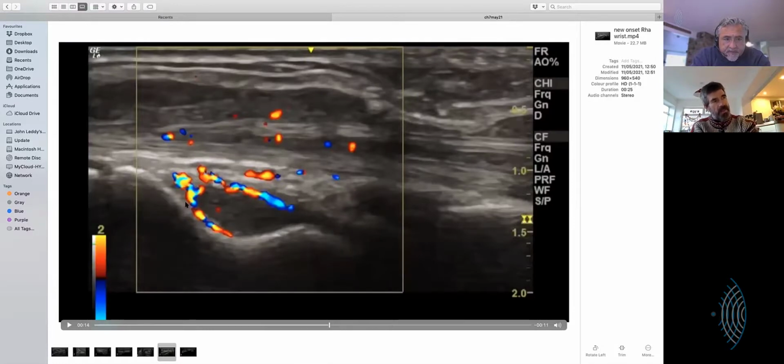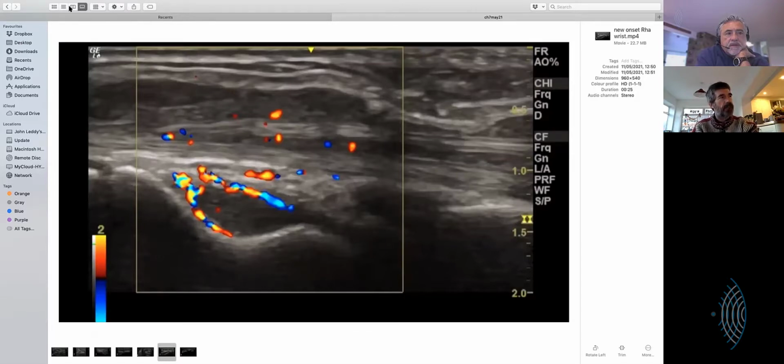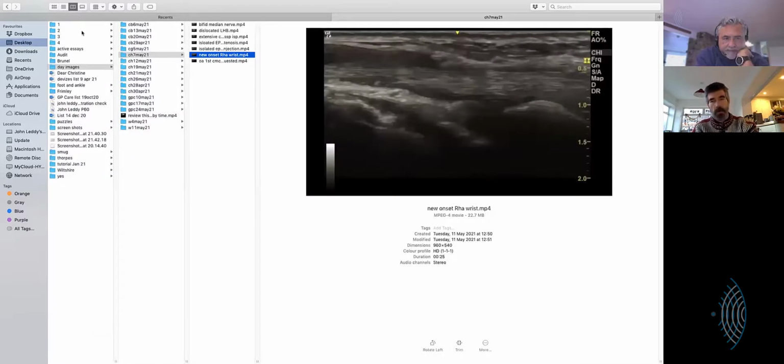Yeah, but that's one of my favorite landmarks because it's so distinctive, the bell shape, like a peanut. Interesting. But yeah, lots of synovitis in the synovial sheath and in the mid-carpal synovium recess.